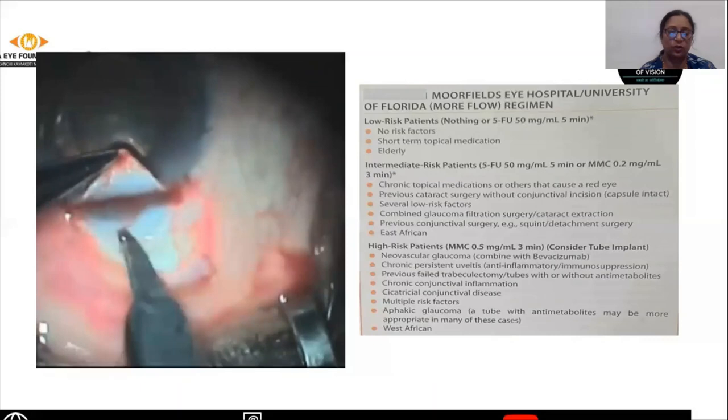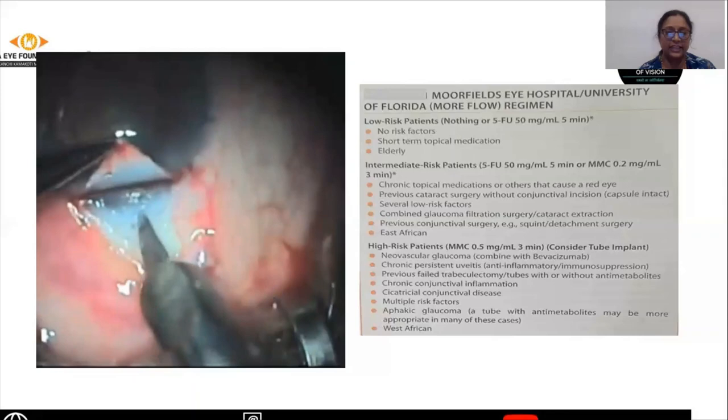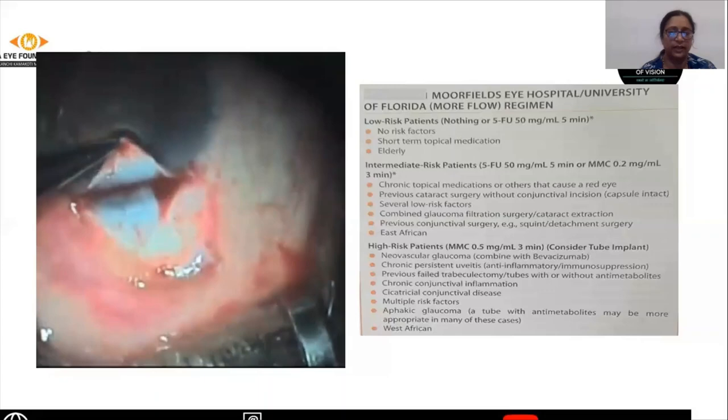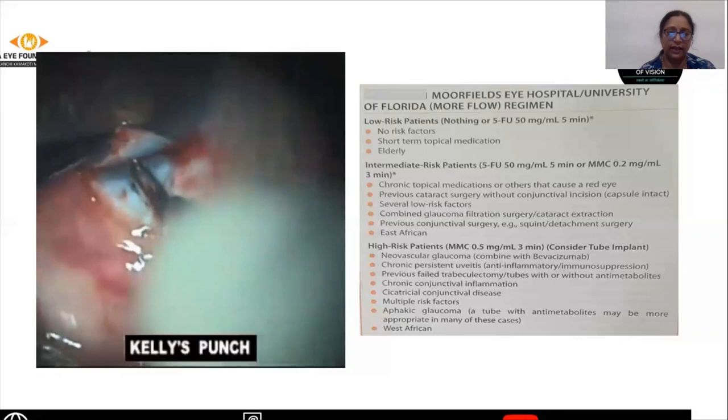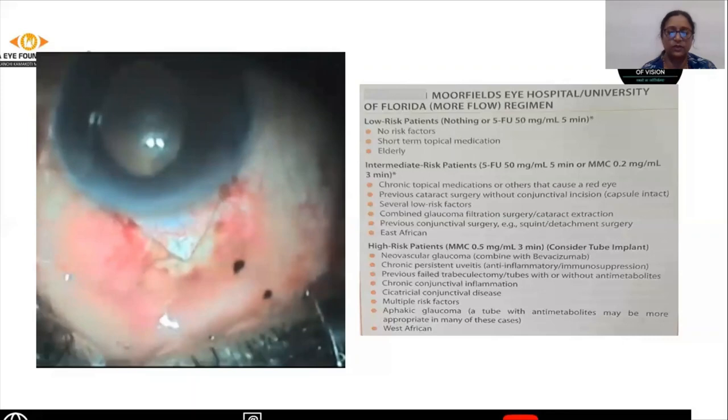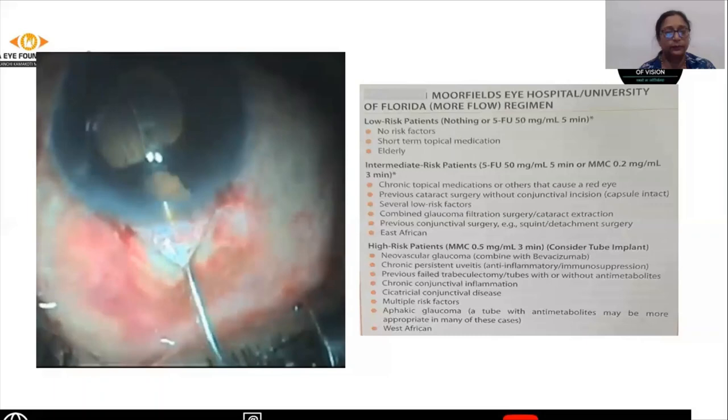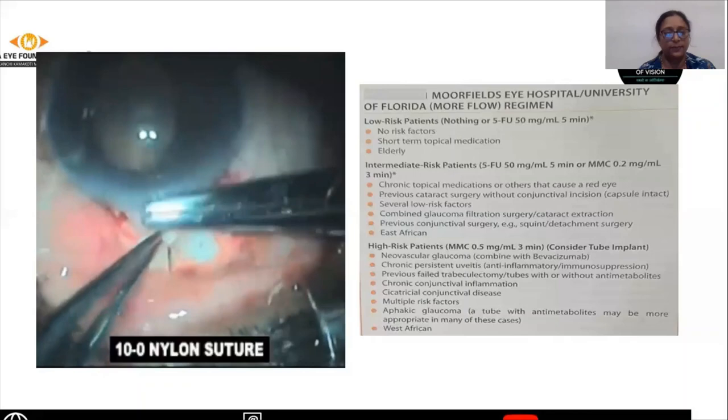Once a deeper dissection of the sclerostomy is done, we will use the Kelly punch to cut that part of the sclerostomy and complete it. The Kelly punch goes inside and in a single punch the sclerostomy is cut. The iris forceps and Vannas are used for doing the PI.